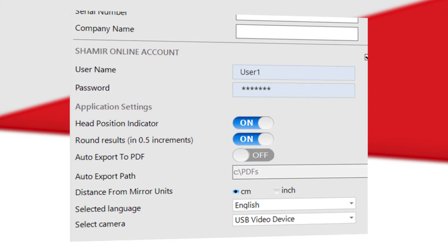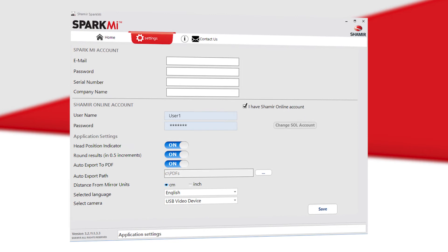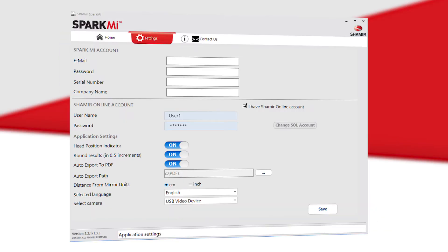Indicate your preferences by clicking the on/off button for these features: head position indicator, presentation of results in 0.5 increments rather than successively. If you want the system to automatically save patient measurements as a PDF file, click the on/off button and choose the directory in which to save it. Choose the application language and make sure the selected camera is USB video device. Once selected, click Save.